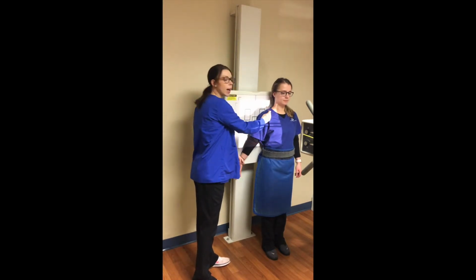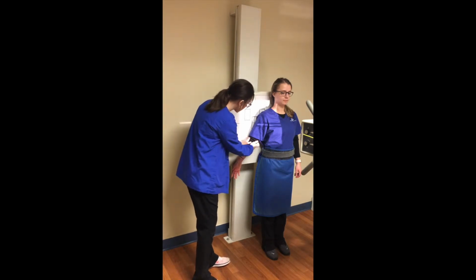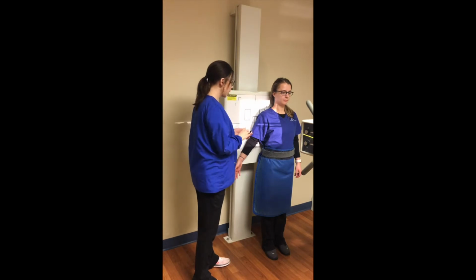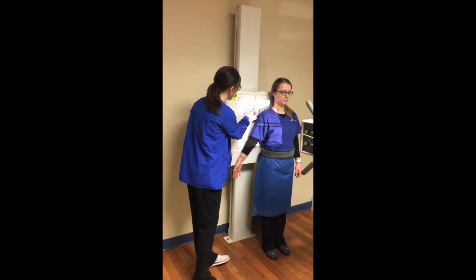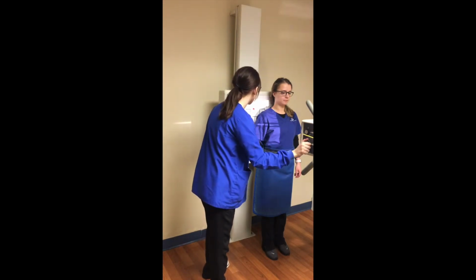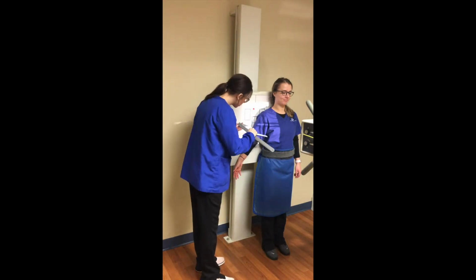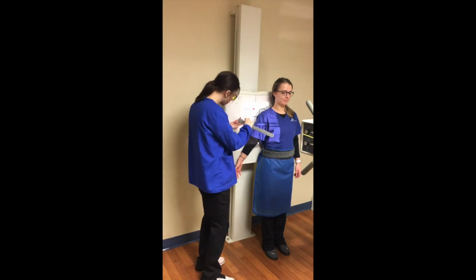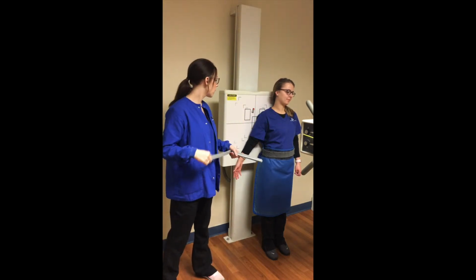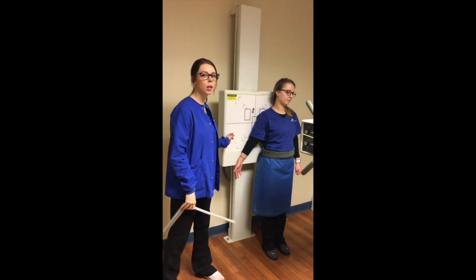And I want to make sure that I have the head of her humerus and both epicondyles in the image. I also want to make sure that they're parallel to the image receptor. I'm going to put a right marker on the lateral side of her arm, and I'm going to collimate down, just slightly. Next, I'll measure her arm. She measures an 8, so I'll go set the control panel, and I'll make sure that I have a small focal spot and that it is on the wall bucky.